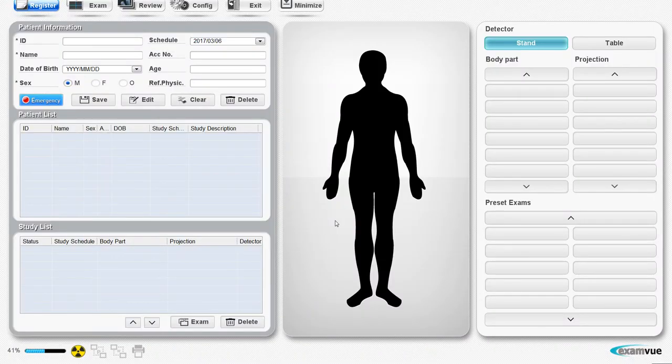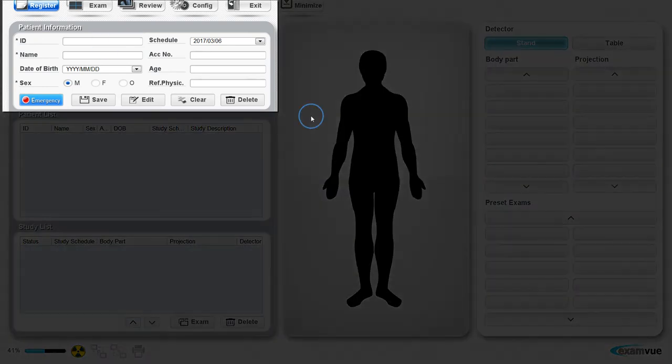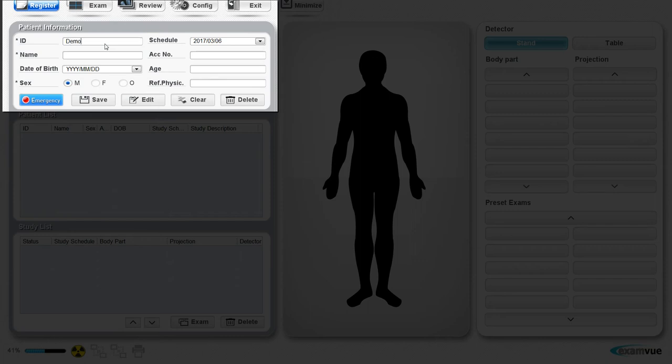From here, you'll enter your patients that are coming in. First step is to enter the ID. This is the most important piece of information because everything else about the patient is linked to the ID number. It can be any combination of letters and numbers. If you already entered an ID that has been saved before, the program will automatically fill in the information for the patient.